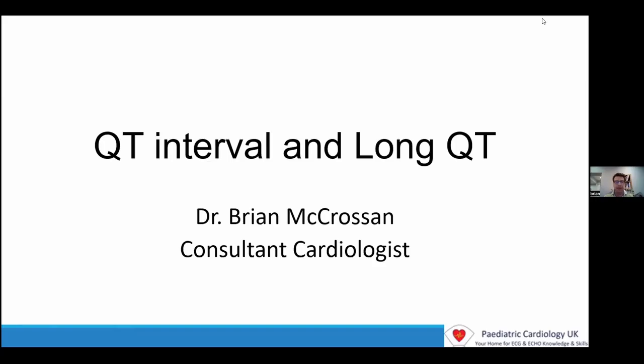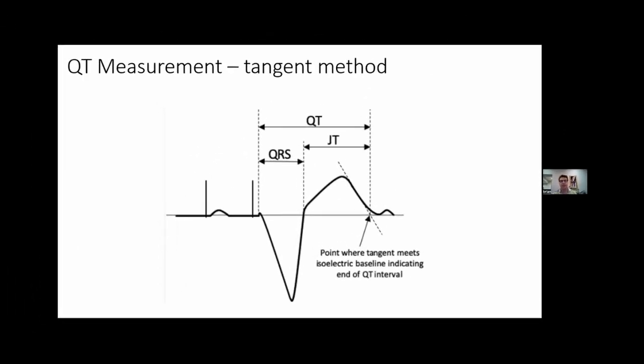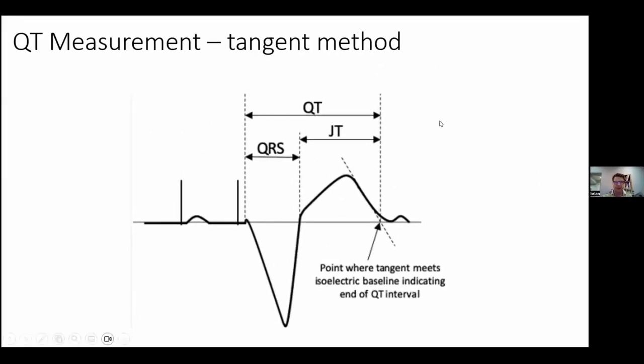Hello everyone, my name is Dr. Brian McCrossan. I'm a consultant pediatric cardiologist, and this session is on QT interval, and we will focus on the basics. This is a very practical thing which you should get used to doing. So just remember, the QT interval is the start of the Q wave to the end of the T wave.